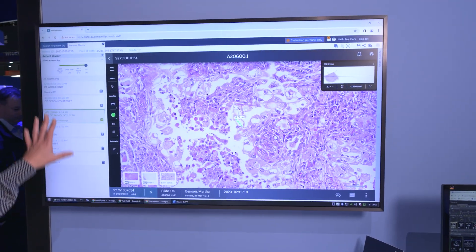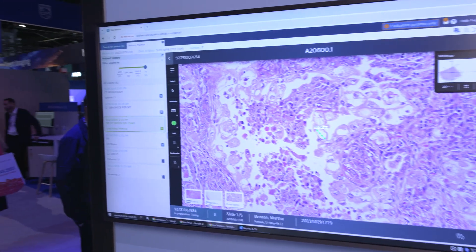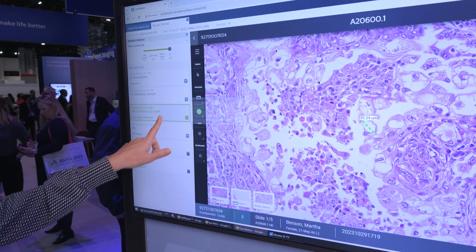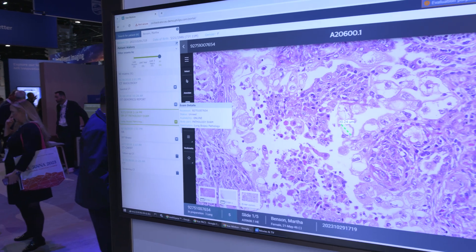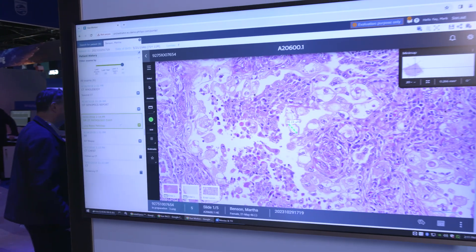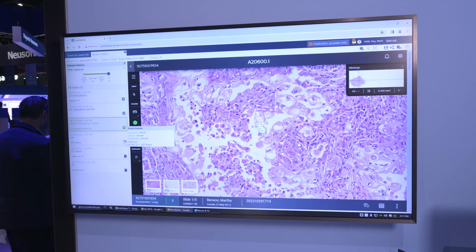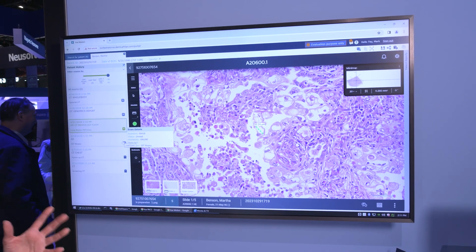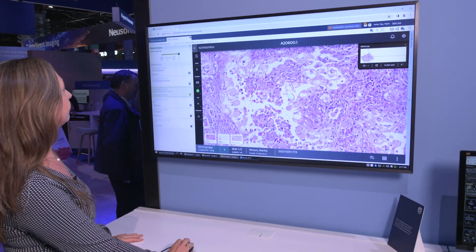Besides the studies that you normally expect, we've added the pathology exam in this overview. And it's not just static reports, but it's the full functional pathology viewer.